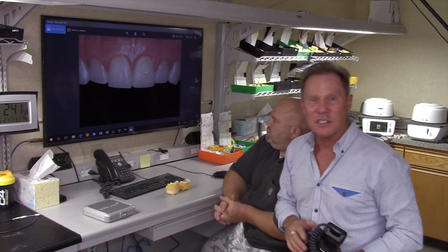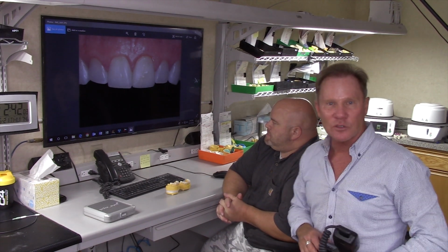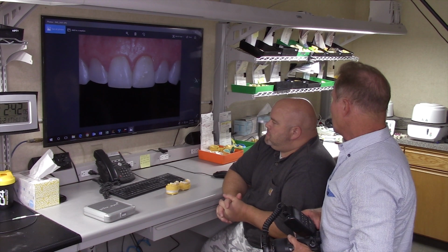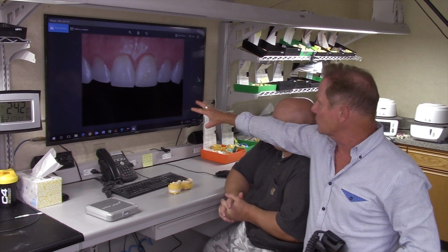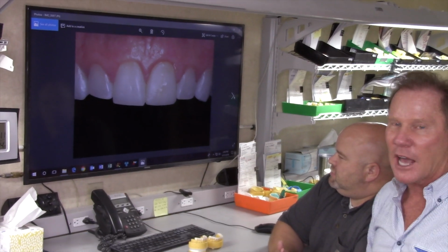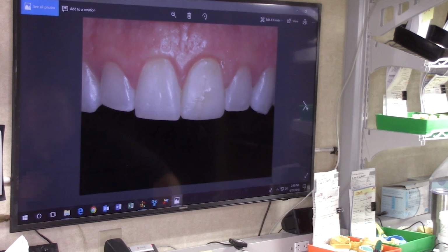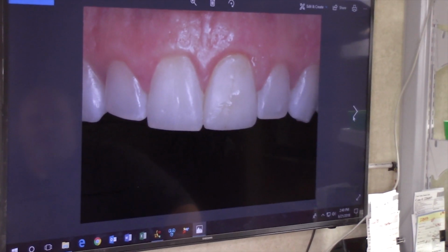So this is a Canon. This is actually a case that I'm doing with Phil. And you can see it's going to be a single central, tooth number 9. And so this is with a contraster. The black background is what we call a contraster. And it's just a black piece of plastic. And it just gives Phil a little bit more information about what's going on at the incisal edge. Any feedback you can talk about that, Phil?